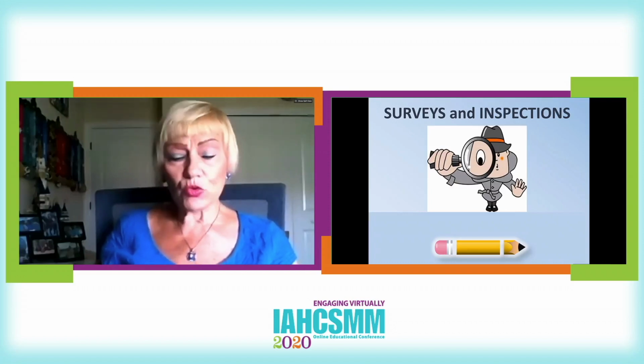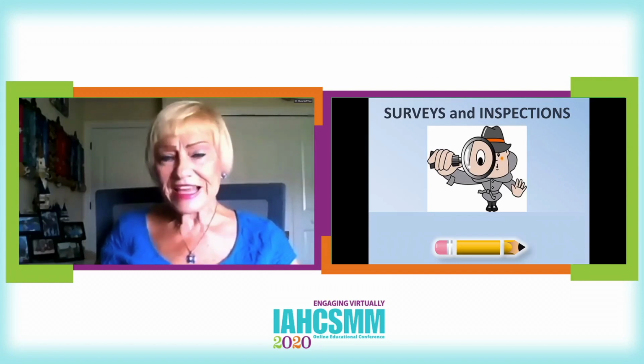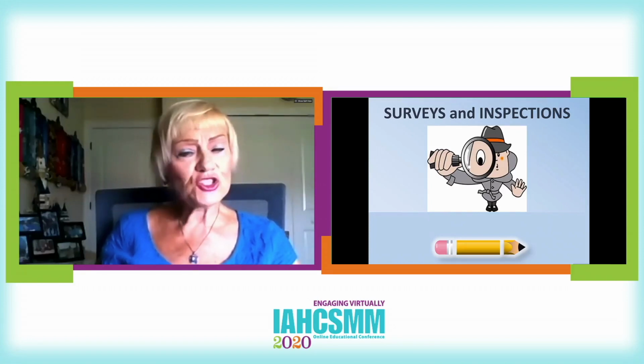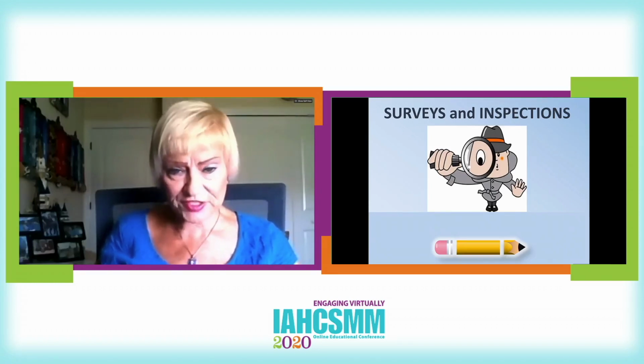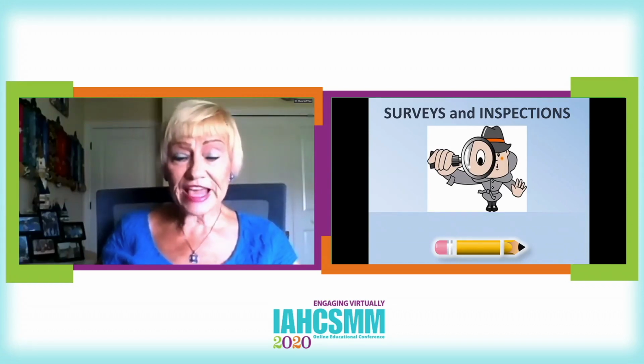You get prepared through orientation, through training of your staff, through the development of competencies, through policy and procedure formation that is current and usable and known to the staff. You can't have thousands of pages of policies and procedures, and that's not an exaggeration, and I would say even hundreds of pages, because it is not realistic that your staff would be able to answer questions of a surveyor or an inspector, because it just isn't possible for them to know all of those pages and memorize them. Your documentation needs to include your instructions for use, as well as your SDS, your safety data sheets.